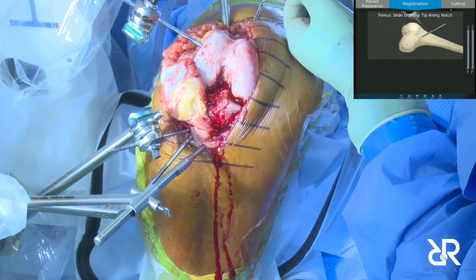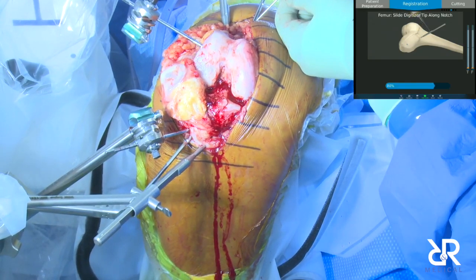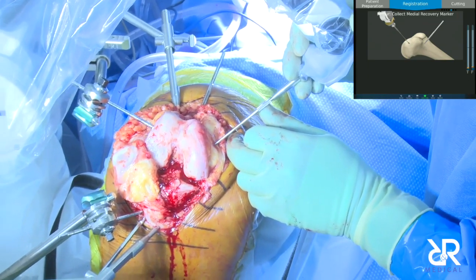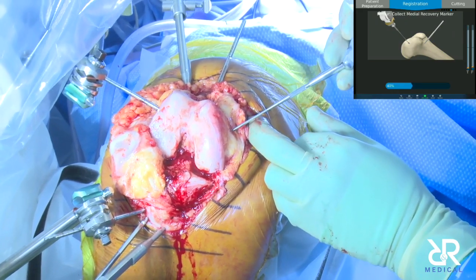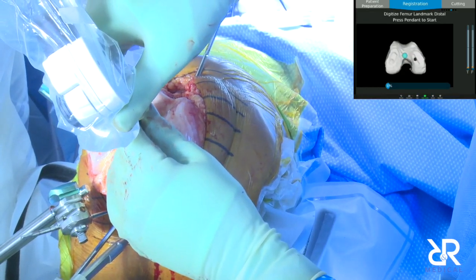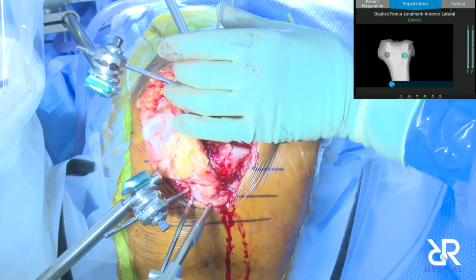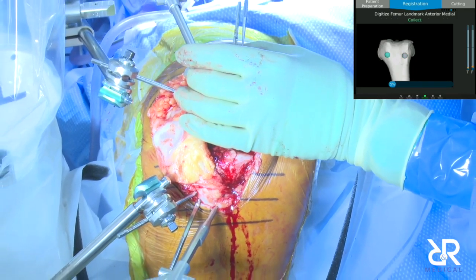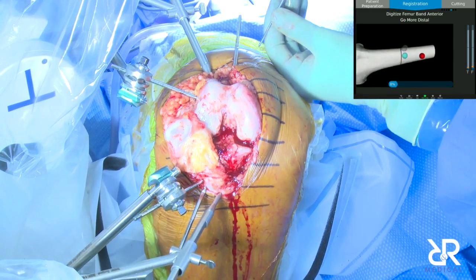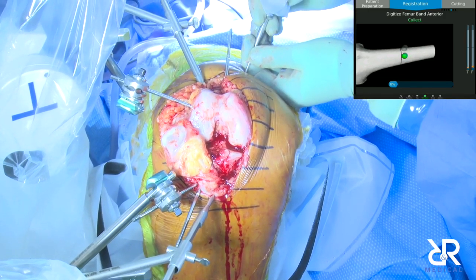All right, slider. Go. So you do the slider first, and then the checkpoint. Go. So with the new software, this band goes away, which is going to be nice, because that's a little bit of a pain. Go. Okay.